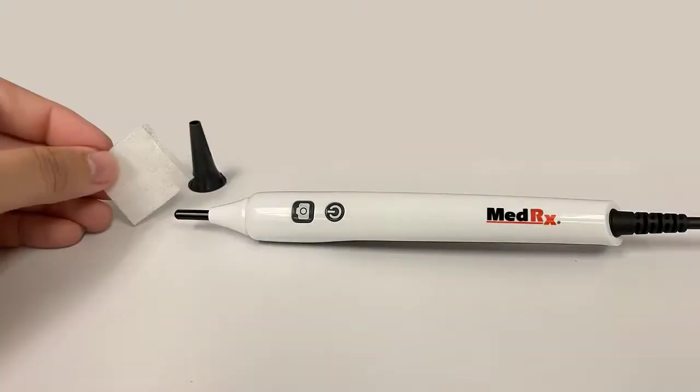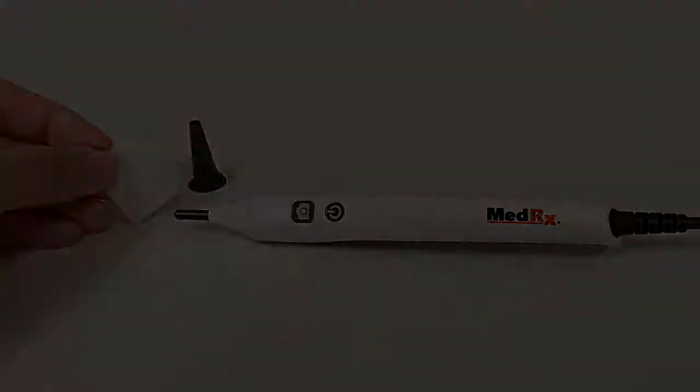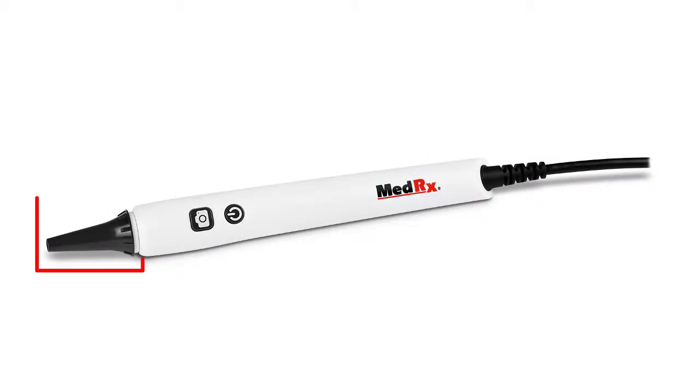Before using the otoscope you want to make sure that you clean the lens at the end of the otoscope before you place the specula on. Always use a new or a clean specula for each patient.